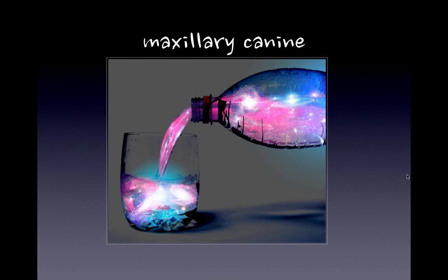What do I mean by step back two steps? What I mean is if I'm going for an anterior final shade of B1, my first layer, my dentin first lingual layer, will be A2. So I'm stepping back two shades. I'm sorry if I misconstrued that. I'm stepping back two shades from the shade that I want to achieve in the anterior. So my lingual base is going to be two shades darker than my anterior final shade. I hope that clears it up. Let's move forward and we'll answer another question.